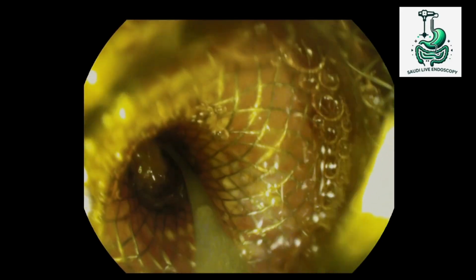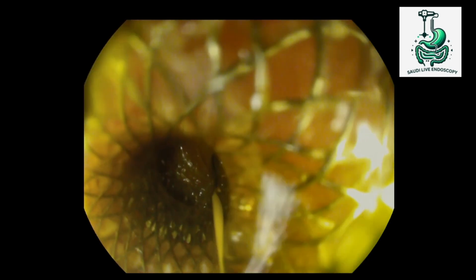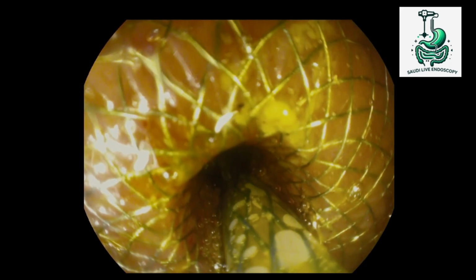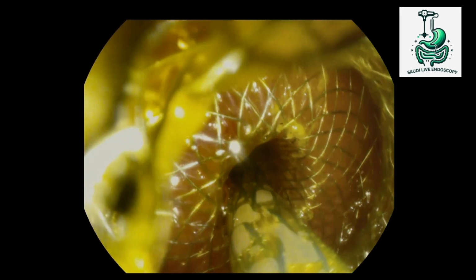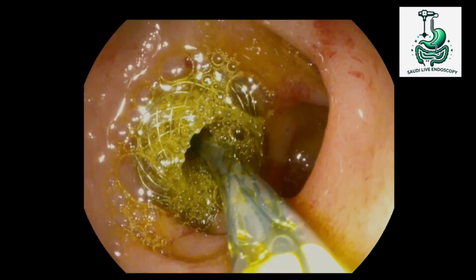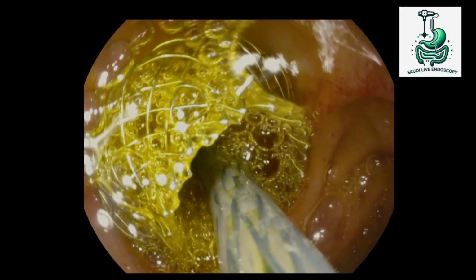So this is a patient where I had a misplacement of the distal flange. I work in a non-fluoroscopic room, so I saw the hole of the bile duct. I placed a guide wire. Then I had a very good nurse that day, so I told her, run and get a fully covered 4 centimeter metal stent that was placed with no fluoroscopy in the endoscopy room. And the patient went well. She had some pain, clearly, but then the day after was completely normal.